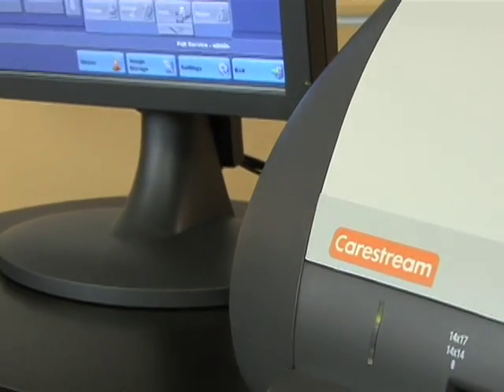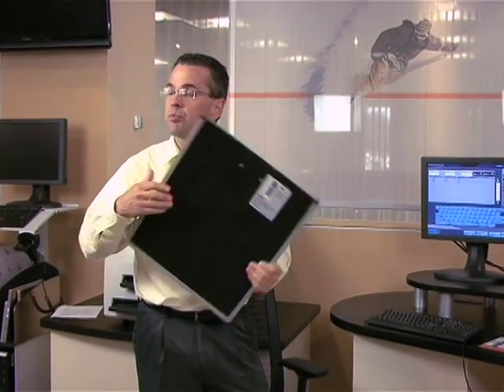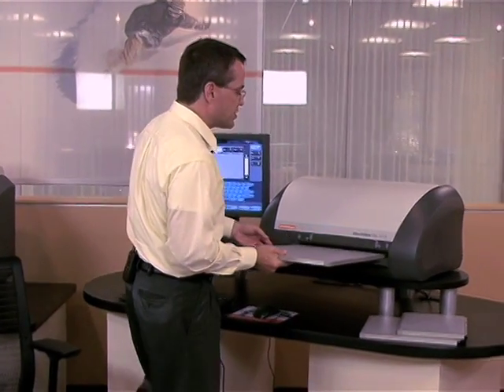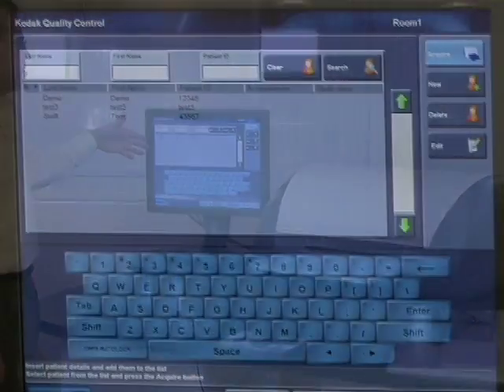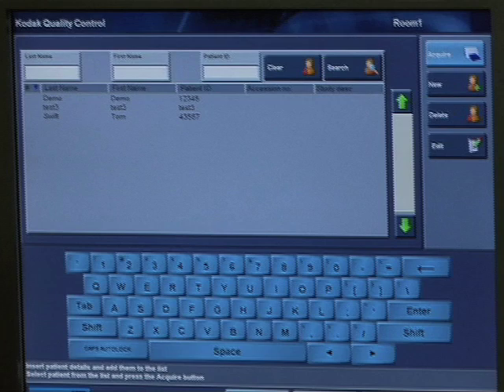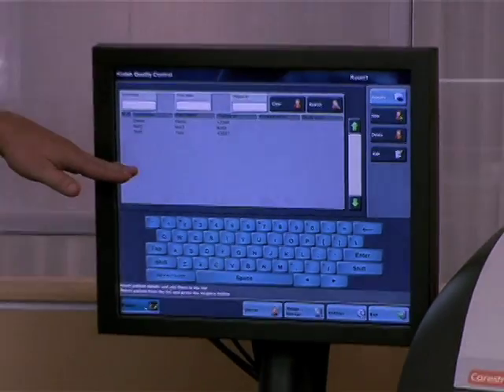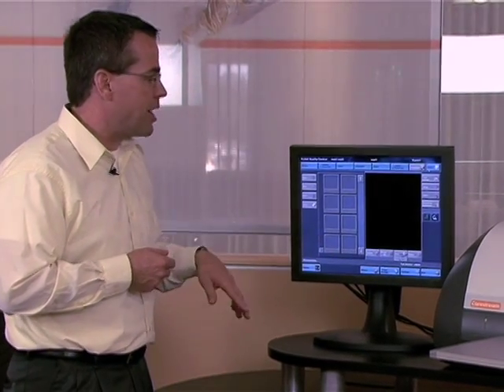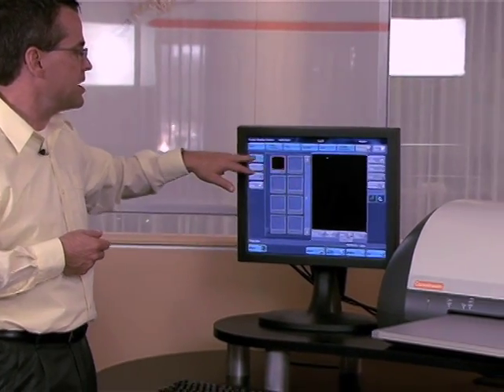Many of you are probably curious how the system works. Basically, you're going to go into the x-ray room with the cassette with the preloaded phosphor screen. You're going to do the exposure just like you would with film. Once you've had the exposure, you're going to insert the cassette into the CR. You're going to choose the patient from a pull-down list. These patient lists can be pre-populated from a WRIS system if you have that connected to your network, so you can obtain the modality worklist. After you've selected the patient, you're going to go into acquire, choose a body part and projection, and hit scan.